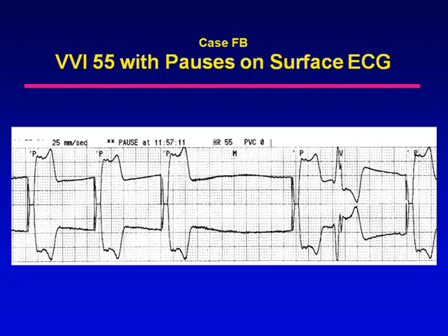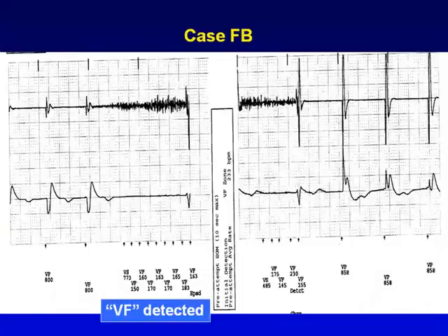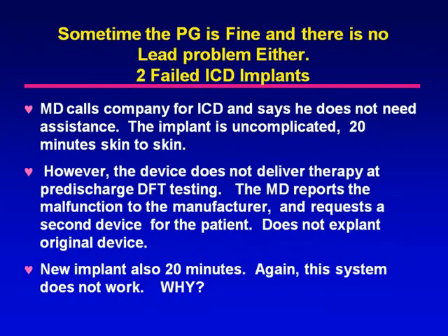We're going to have a talk later on troubleshooting, so I guess you can guess what this is. This is a lead that's being inhibited by excess noise. And the last one there.